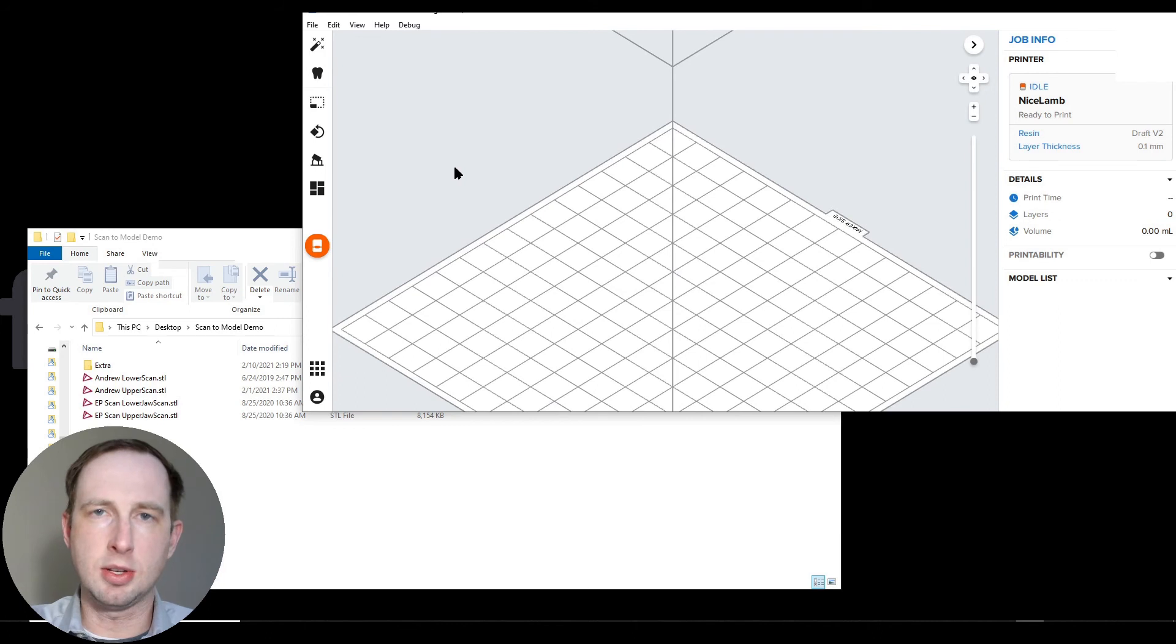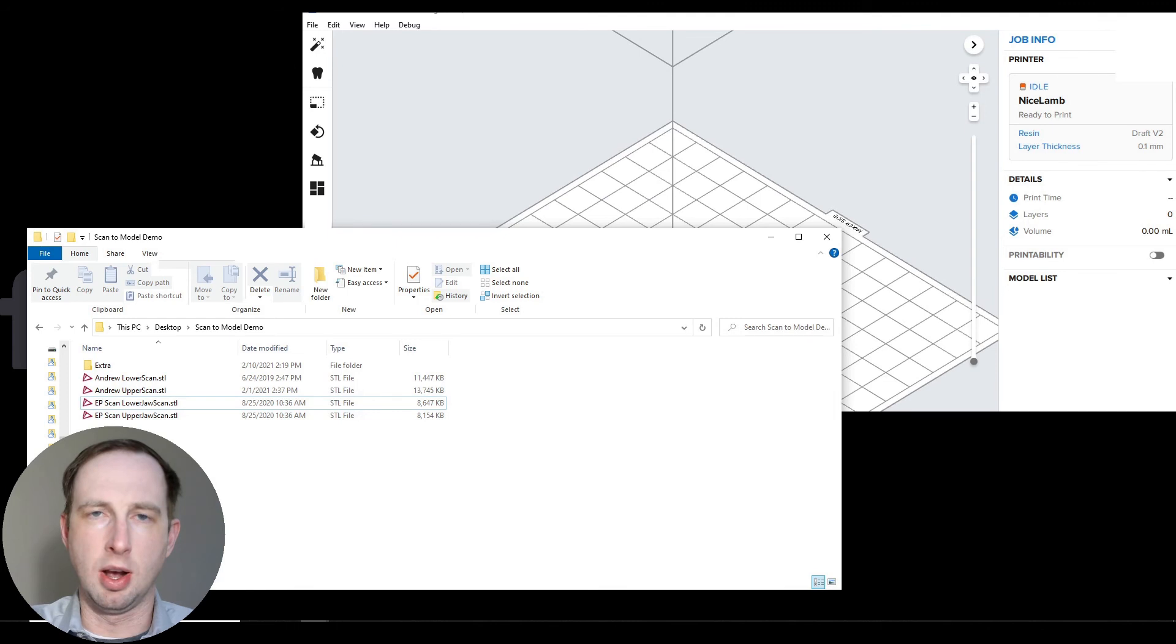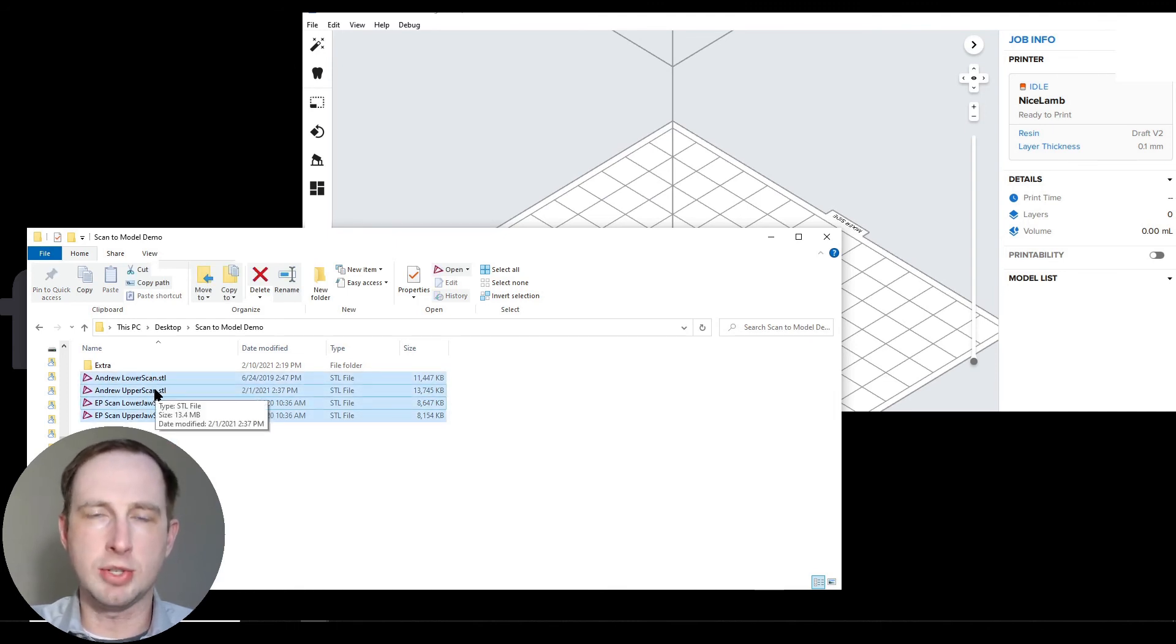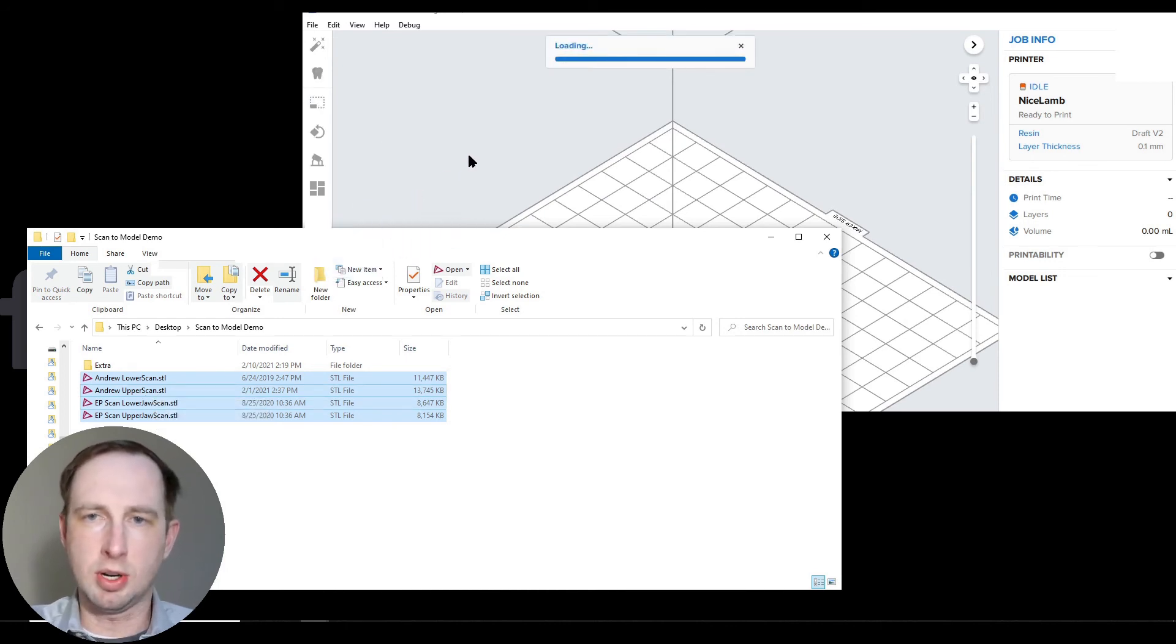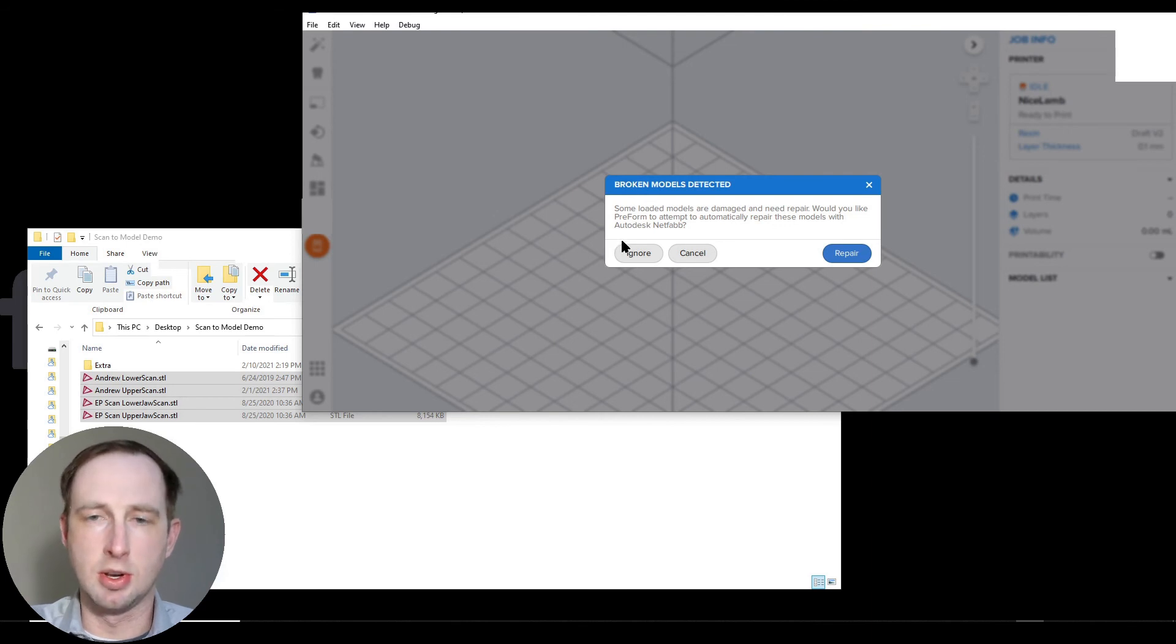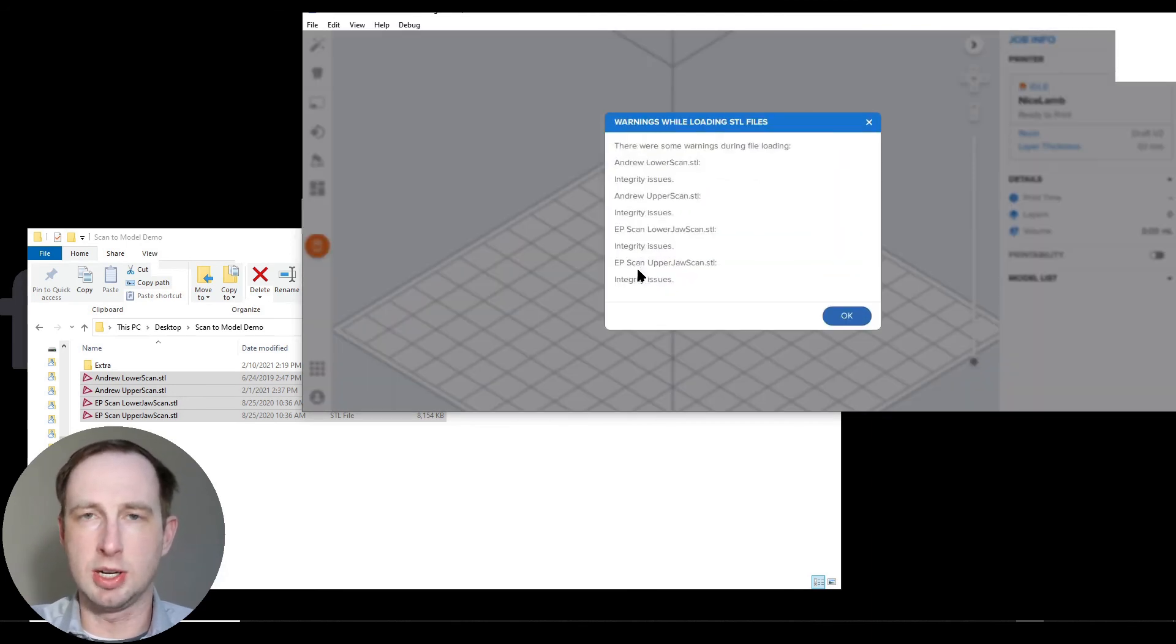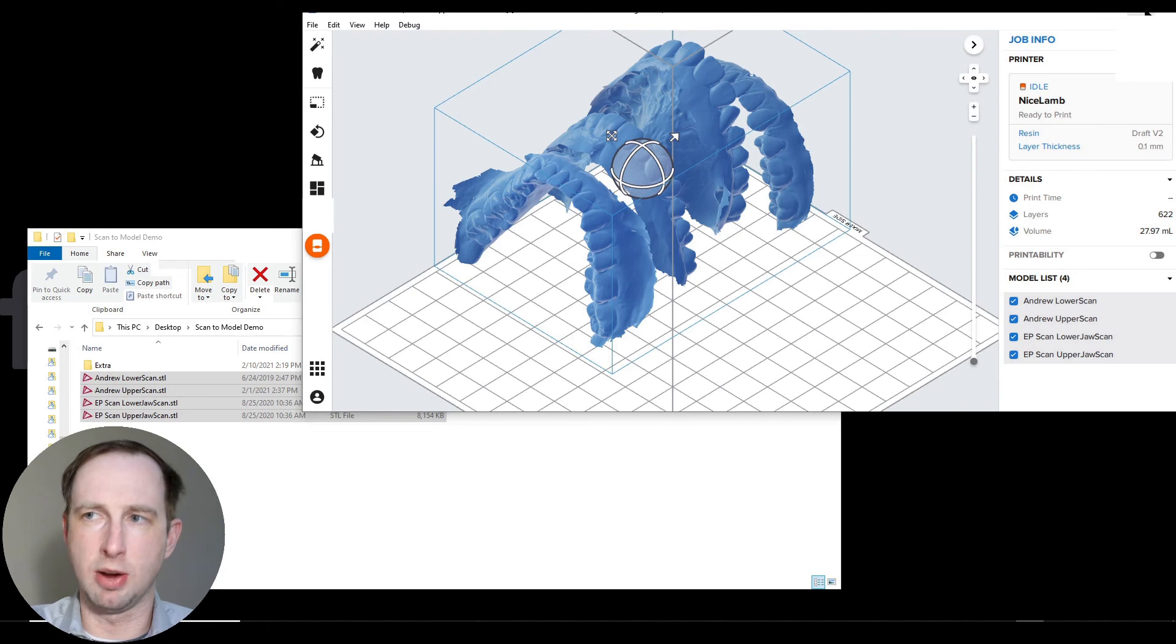The way to start is we're going to be dragging in all the files that we want to build at once. Today I'm showing two model sets, so two uppers, two lowers from two different people. Just drag them right in. Critically, Preform is going to try to repair this mesh, thinking that it's a non-manifold mesh. You want to ignore this. That's one of the trickiness to this workflow. Just ignore these warning boxes for now.